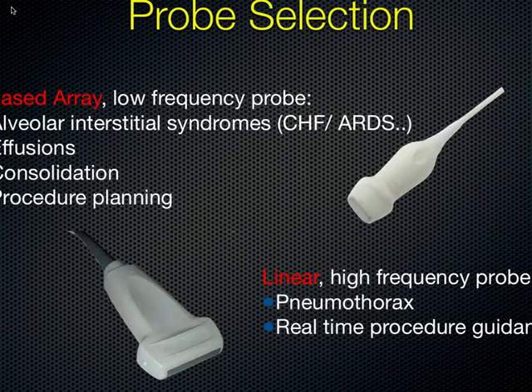In contrast, the linear probe is a higher frequency probe which gives you a great deal of detail but not a great deal of depth. We use this to evaluate the pleural line for pneumothorax, as well as to allow for real-time guidance of our procedures.